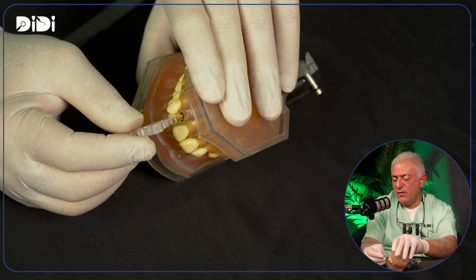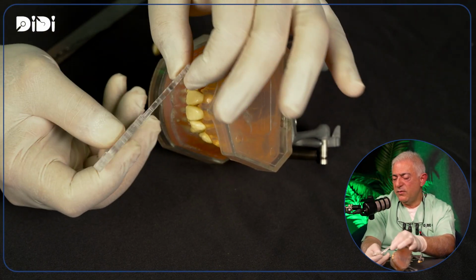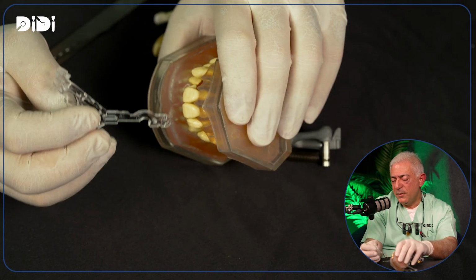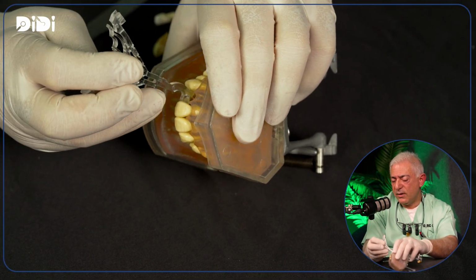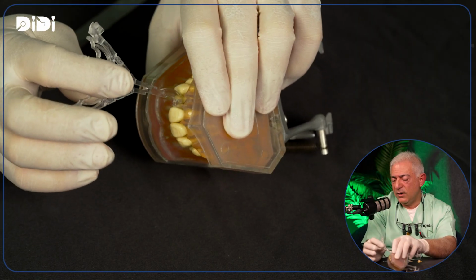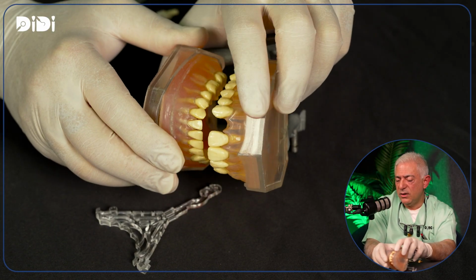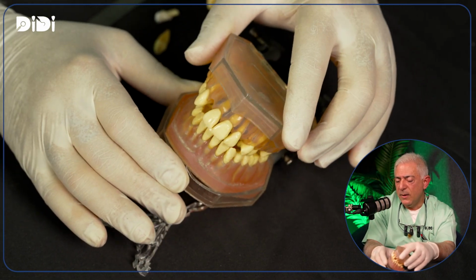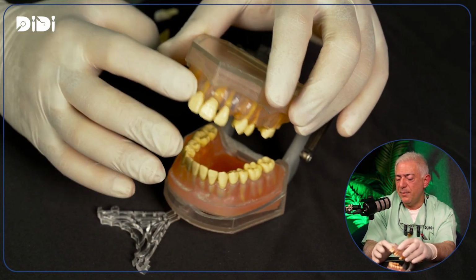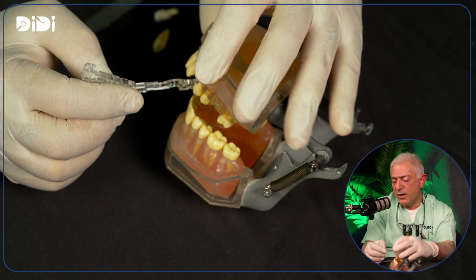Now imagine even the 5 millimeter doesn't go in. This part of the device is 3 millimeter. So if you only have 3 millimeter, that means you definitely have to increase the vertical dimension or do an orthodontic intrusion or do something, and don't promise the patient an implant when you cannot restore the case.